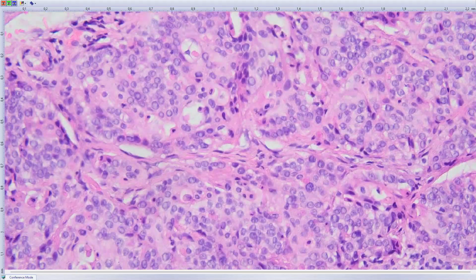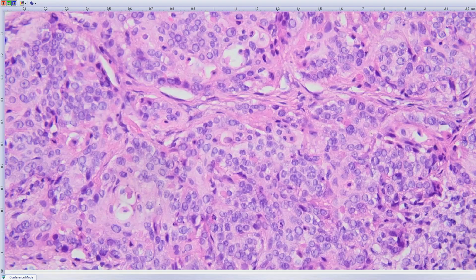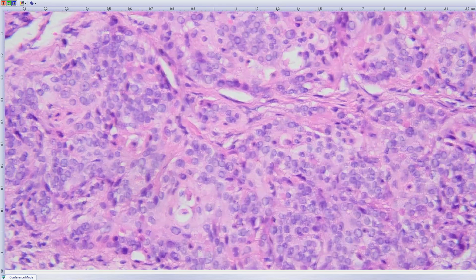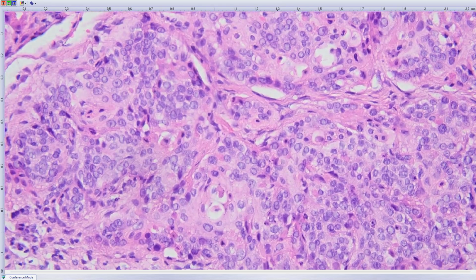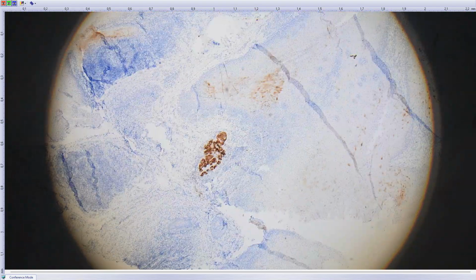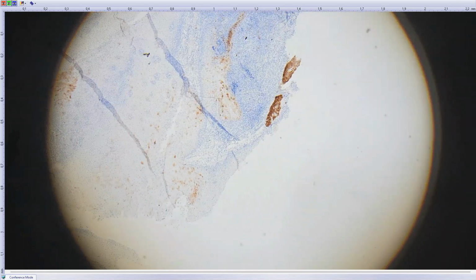It's a little bit different. The tumor cells have more cytoplasm, maybe with a little bit of keratinization here, so partially keratinizing. And again, there is no in situ diagnosis inside the tonsillar carcinoma because the tonsil does not have basal membranes. Yeah. So this is P16 staining again.